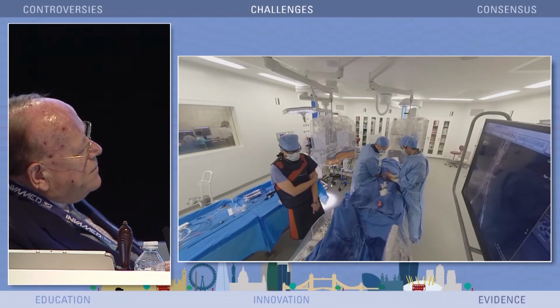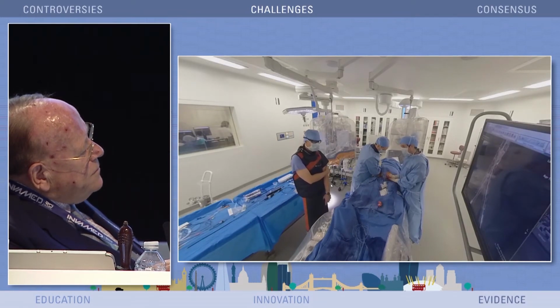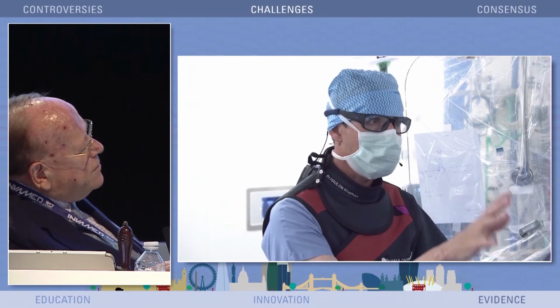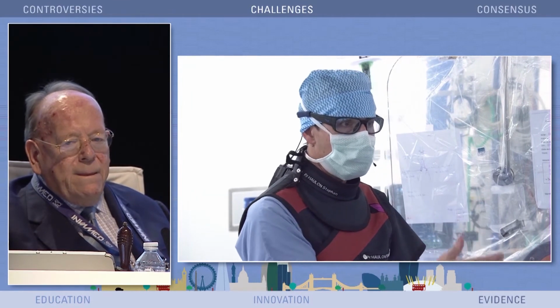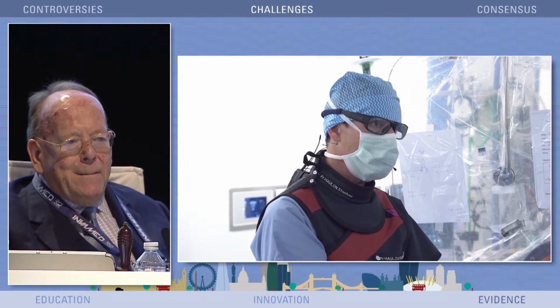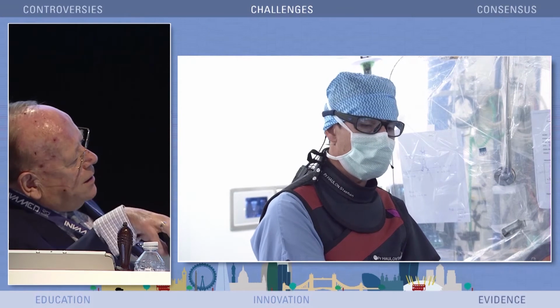That's a very important point, Roger. I mean, 3D imaging now is used to select the patient, to design the endograft, to guide us throughout the procedure, and to check technical success at the end of the procedure. So if there was any issue, I would fix it right away. And so this will obviously reduce the number of secondary procedures for limb occlusion or for type 1 endoleaks. And also this will reduce the hospital stay and reduce the need for secondary procedure during follow-up.